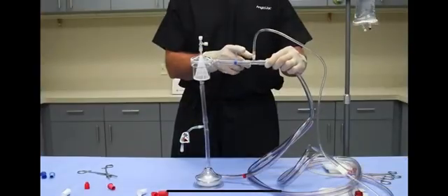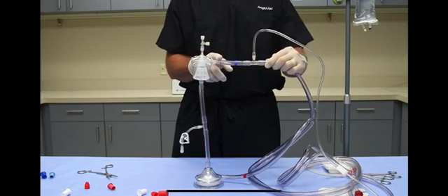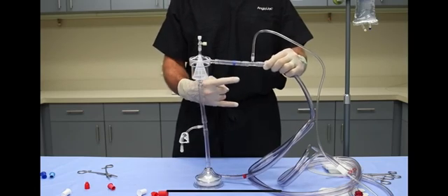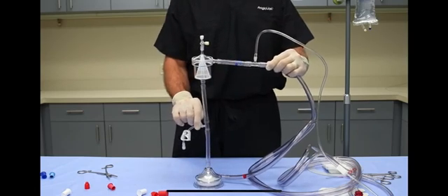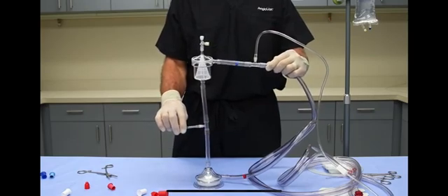When your circuit assembly is complete, it should look like this. Prime line faces up, inlet of the bubble trap and outlet of the pump head face the same direction, and finally, the waste line on the T-piece faces opposite direction of the outflow of the pump head.